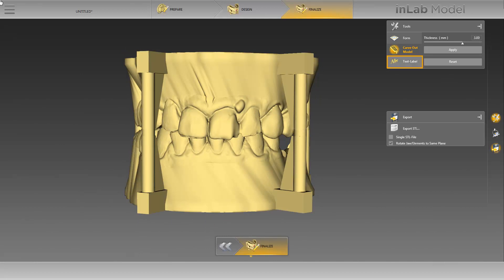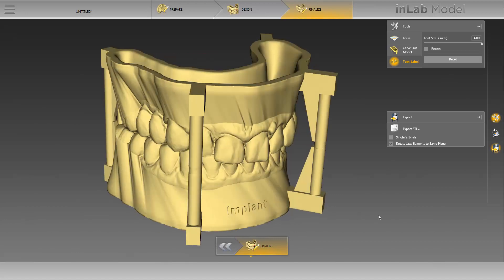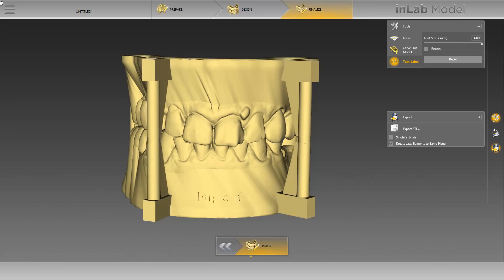Next, we activate the text label tool and use it to add text to our models. We move the cursor to a suitable location and type in the desired label without clicking again. You can use this tool to assign models to patients, for example. In our case, we write Implant. Double-clicking will confirm the label and allows you to add further labels. By activating the recess option, the label is recessed instead of being applied on the model. To avoid accidentally adding further text to the models, we will deactivate the tool when finished.